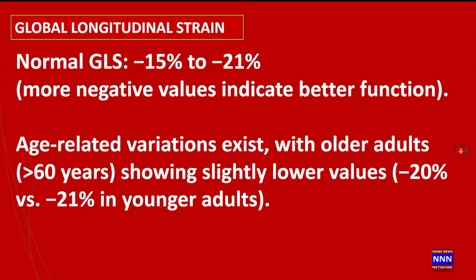This reduced systolic function could be in a certain area like the inferior wall or the lateral wall or the anterior wall, or it could be patchy. It could involve multiple small segments. And that's the beauty of this. This is the only test that will help us to identify regional wall motion abnormalities.